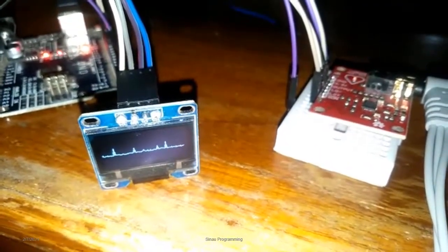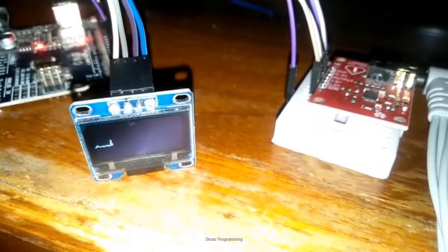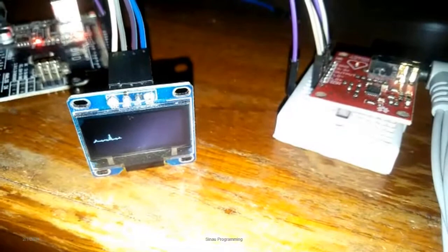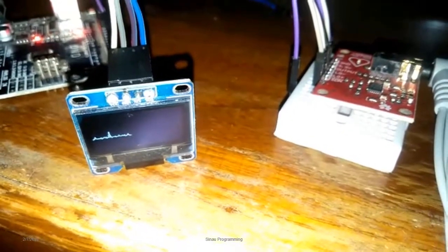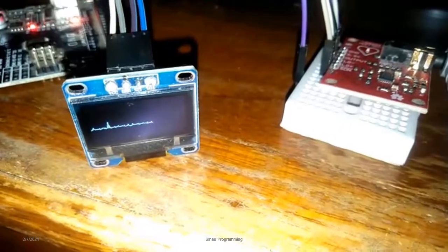Hi everyone, thank you for staying with us. Now we learn heart rate with AD8232 module based on Arduino. This is a simple solution when you want to check your heart rate or research about this module.